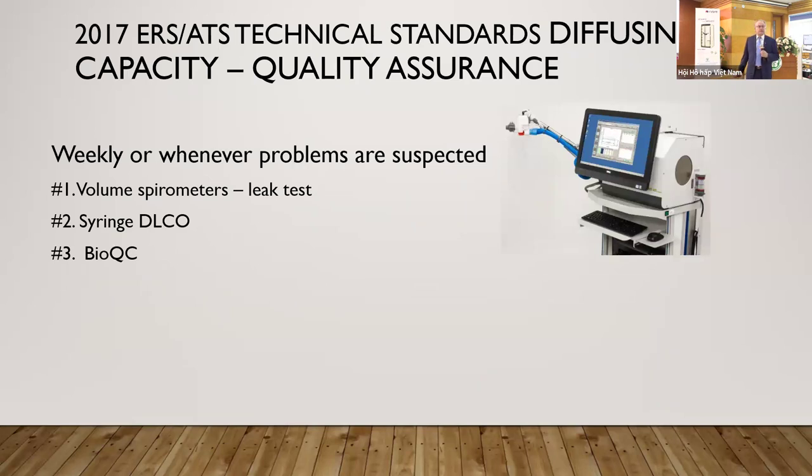So what is described in DLCO is these quality models need to be performed weekly. So in lung volumes and in volume measurements, it's once a month. But when you're talking about diffusion of the lung, that is once a week. They include the leak test, the syringe DLCO, and BioQC.